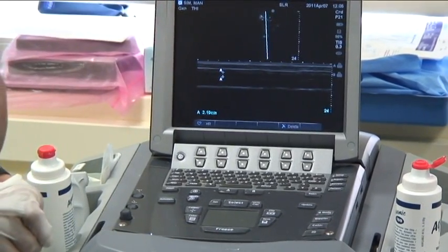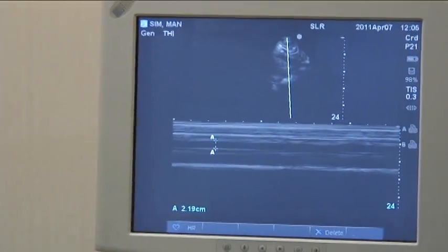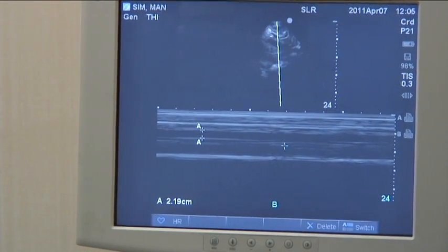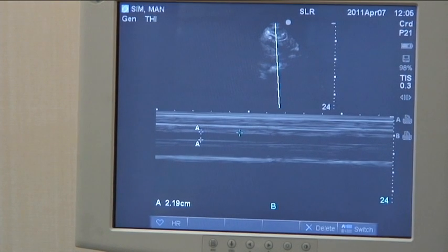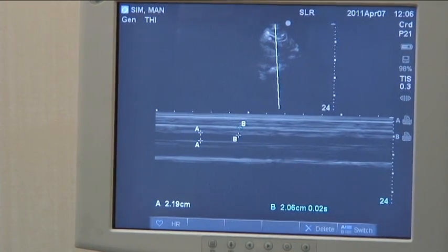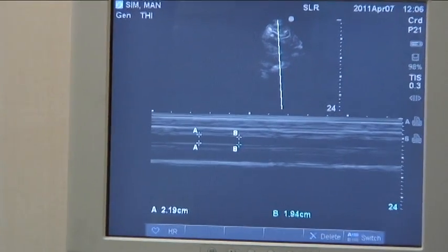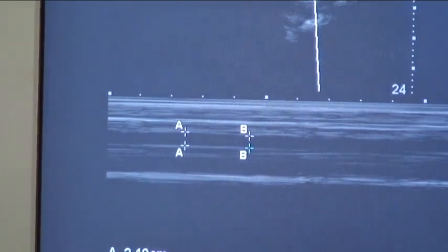this is on expiration. As you see, it collapses a little bit on inspiration, and then you hit caliper again, then another indicator comes up. Now this is the second point, where the IVC has narrowed a little bit, and then you hit select again. And this is your second measurement, we call it during inspiration, and then you have it at the other end of the IVC, and then you hit select again.